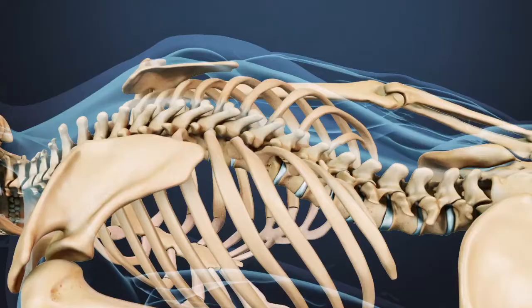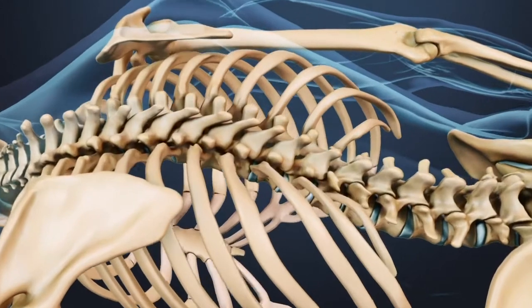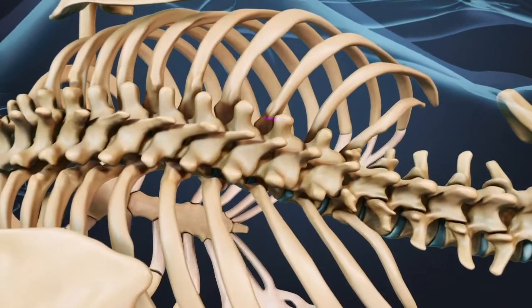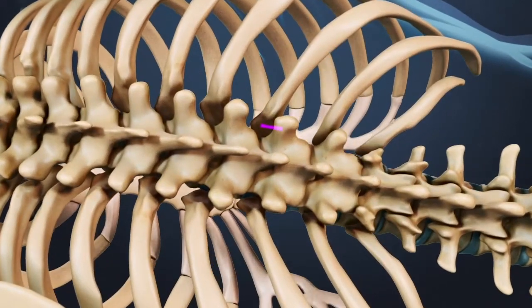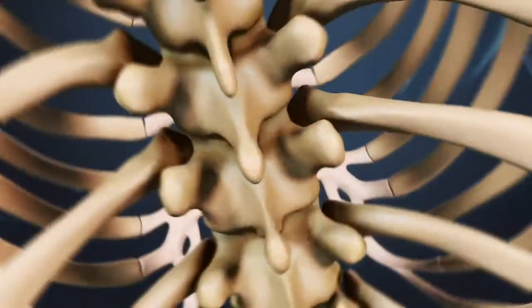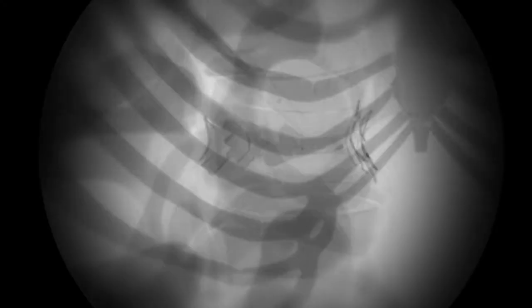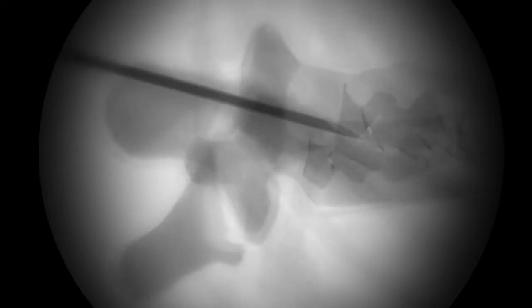In the procedure, the patient lies face down on the operating table. The surgeon makes a small half-inch incision over the affected area. Using x-ray guidance, the surgeon inserts a narrow tube through the pedicle into one side of the fractured vertebra.